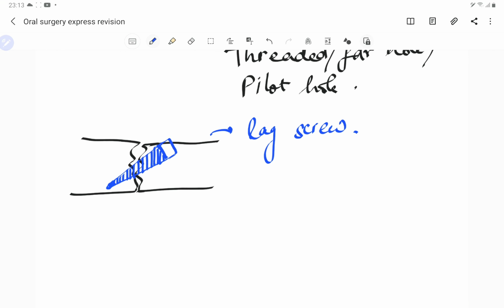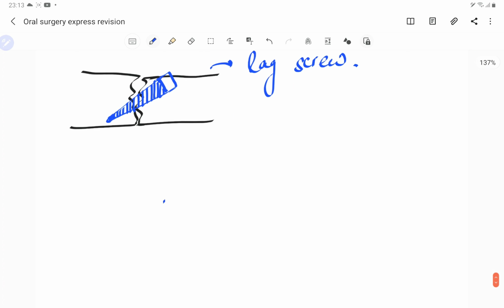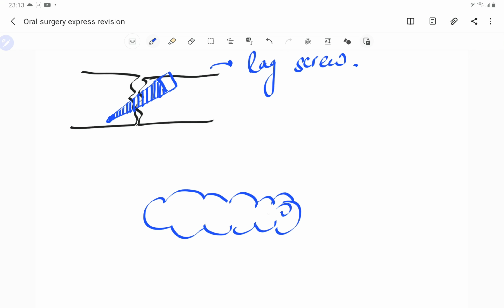We also have covered the compression, non-compression plates and the reconstruction plates, which are the bulky plates. So you will find a plate like this with 6 holes, 1 2 3 on one side and 1 2 3 on the other side, like this, six holes. If you are using only one 6 hole plate, that also gives you the rigid fixation because that is very bulky. So all that we have covered includes all the principles.